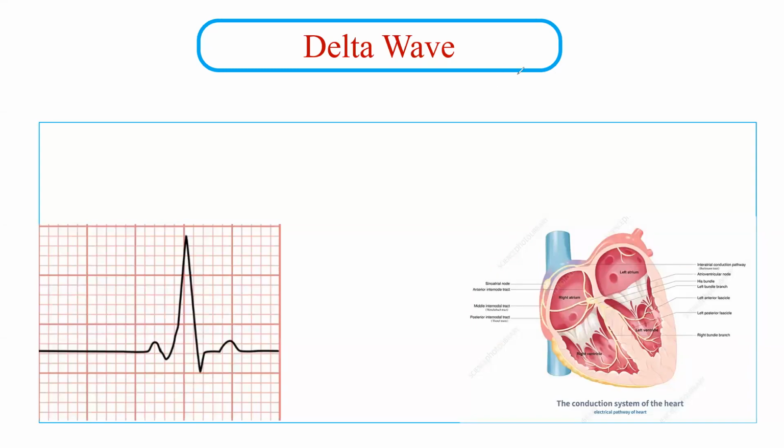Welcome back to our ECG learning series, and in this video, we'll talk about delta wave.